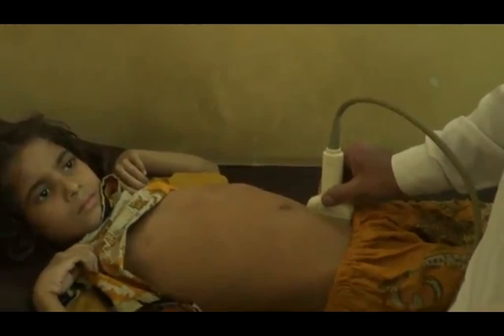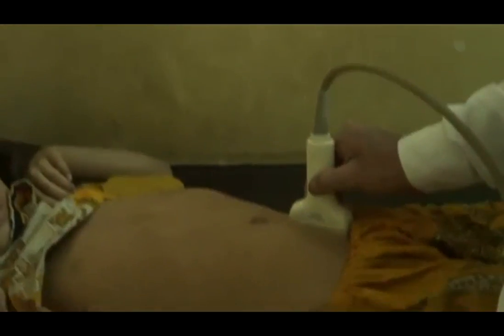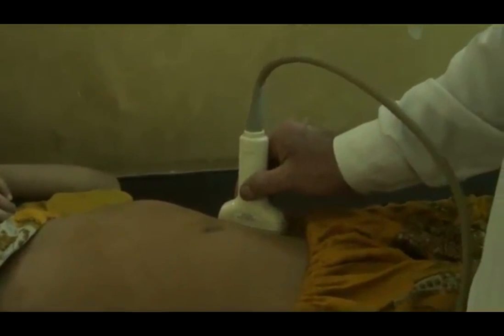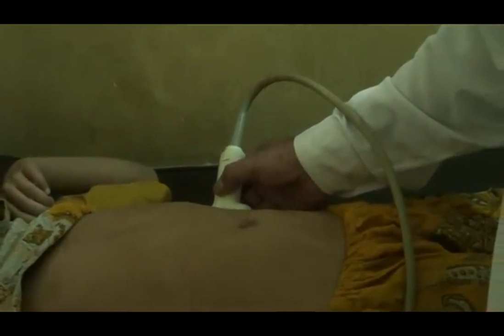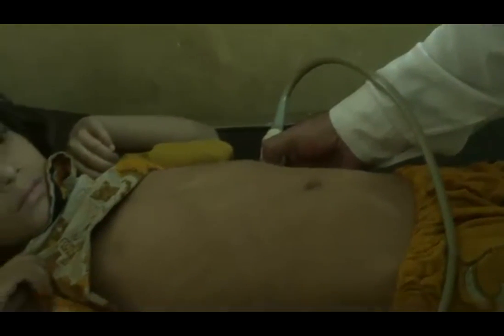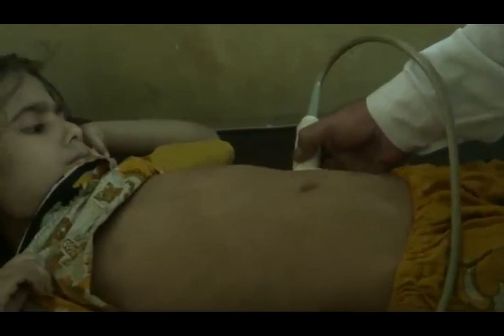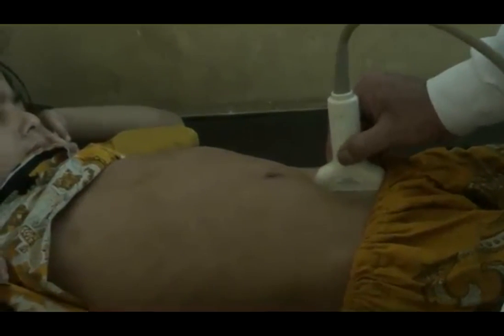If you see that I am here now, I can see the lower end of the tubular structure, and when I move the probe in this direction up to this level, the tubular structure persists from here down up to the left side of the pelvis.